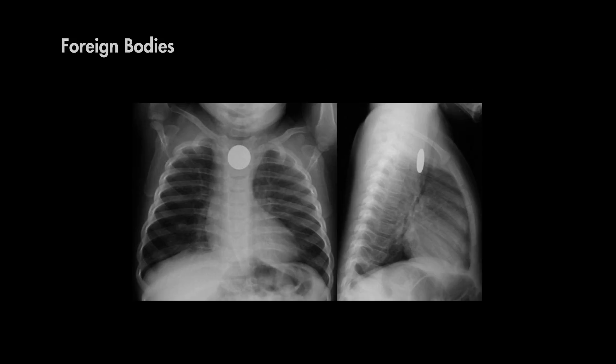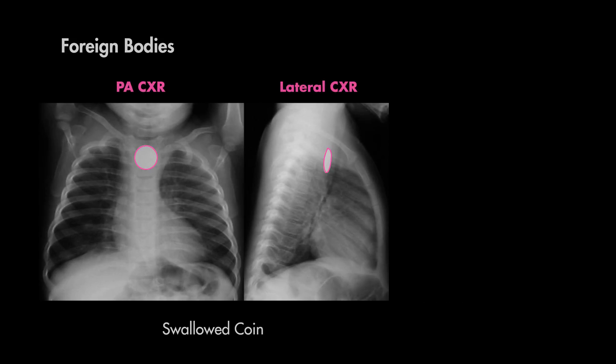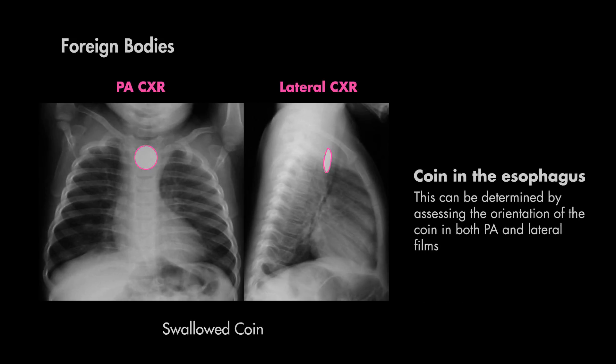Here's another x-ray with a foreign body — can you guess what the object is? If you guessed a coin, then you're right. This is a pediatric patient who swallowed a coin, which is now lodged in the esophagus. You can see how helpful the PA and lateral film is in determining the location of the foreign body and the approximate dimensions of the object.